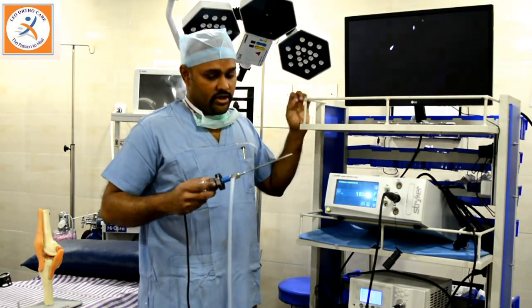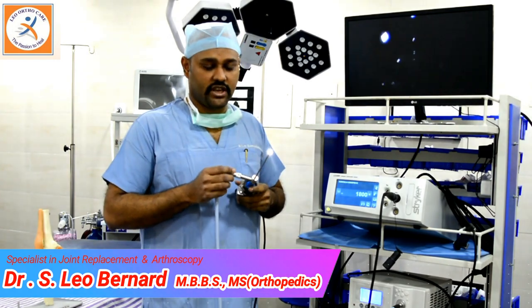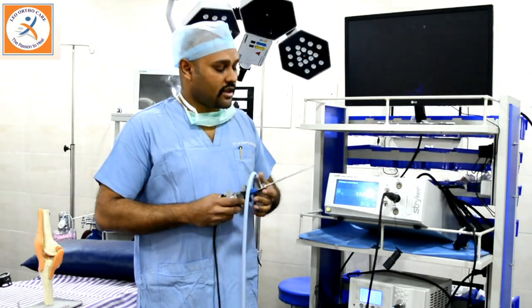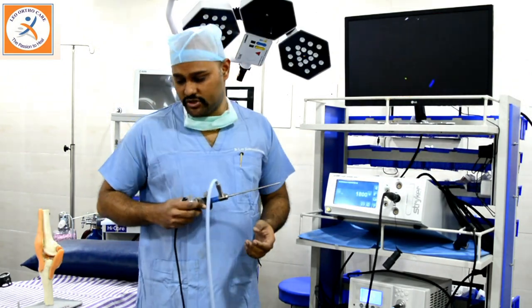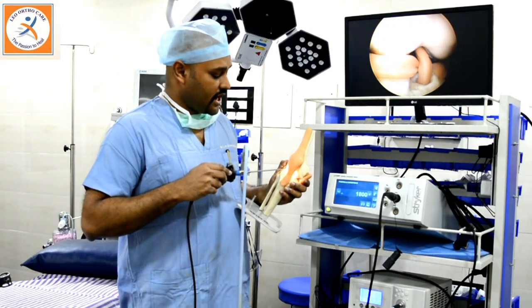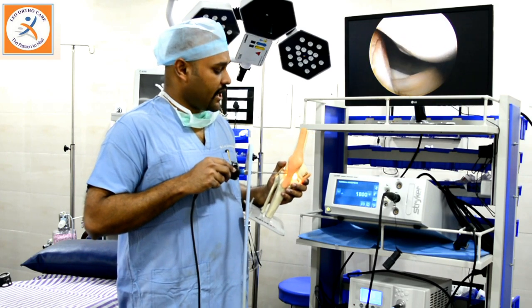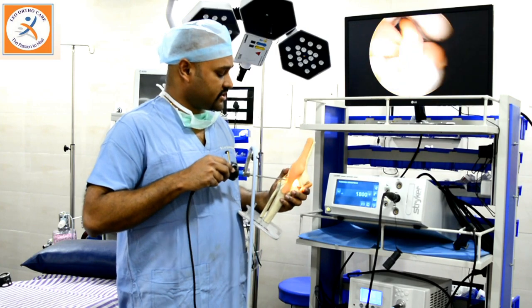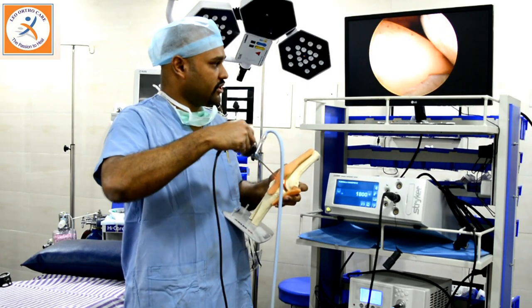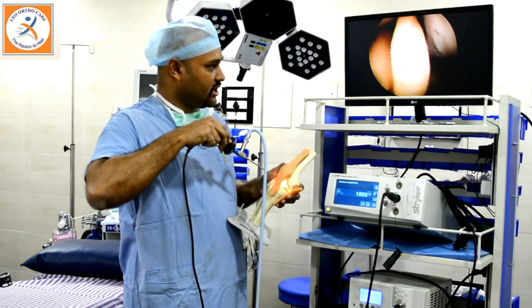Using these machineries, we probe into the joint. This is the scope which is being introduced into the joint — it is just four millimeters in size and gives us a clear picture inside the joint. We introduce the arthroscope by means of small holes and we can visualize inside the joint with up to 20 times magnification. We can reach nearly almost all the structures inside the joint.